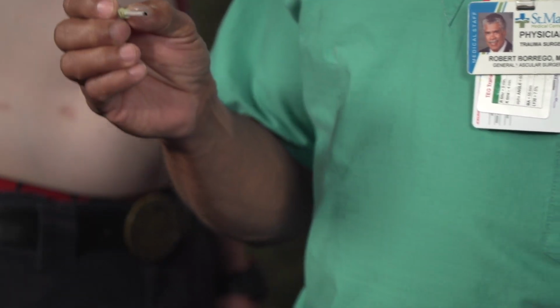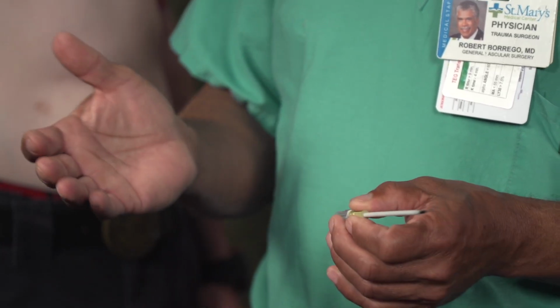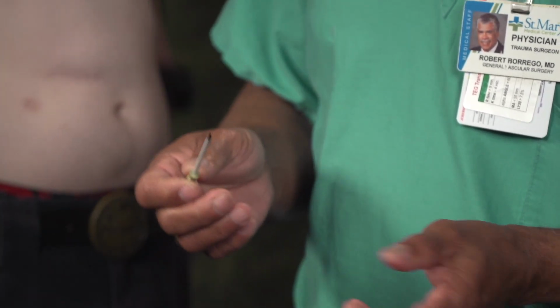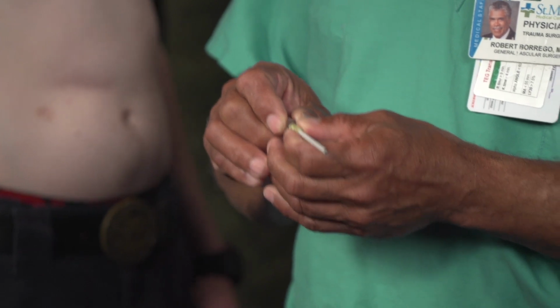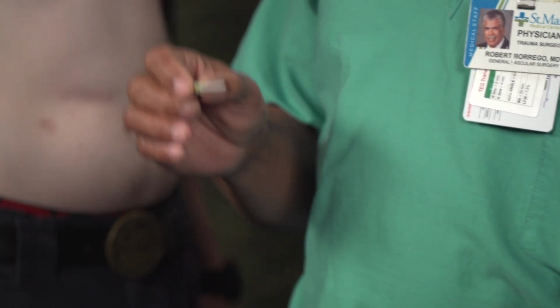If you're doing it blindly, also without the syringe, the minute that you see anything, bubbles, a little bit of bubbles, bloody bubbles, or anything like that, it means that you are already in the chest, and at that point I would try to thread the needle. And remember that it's like everything. It shouldn't take a lot of force. So if you can't push it for some reason and there's resistance, then back out and do it again, because most likely you're not in the right spot.